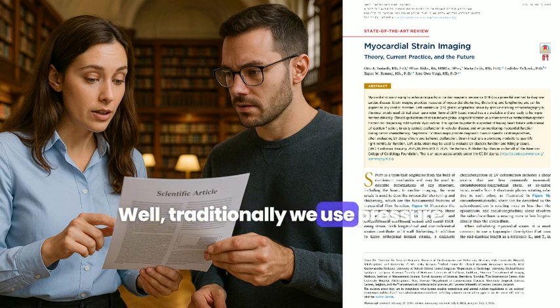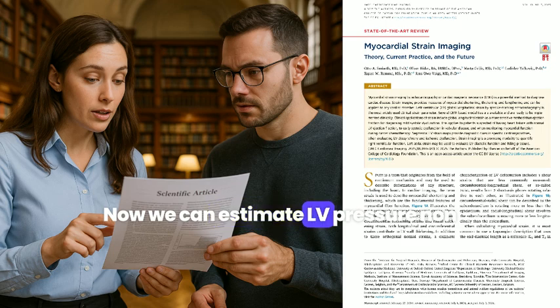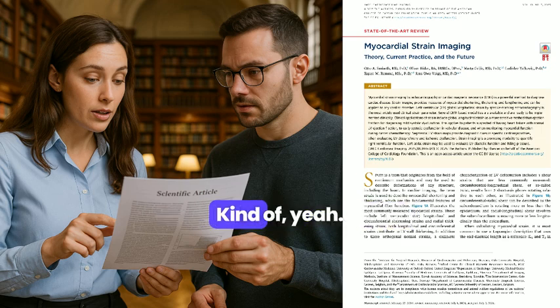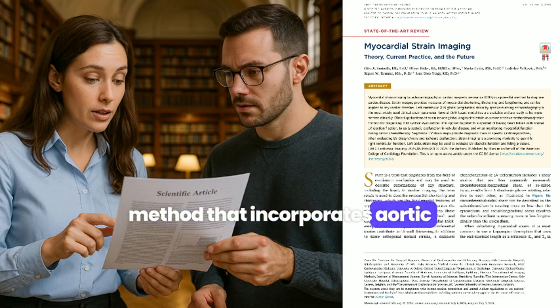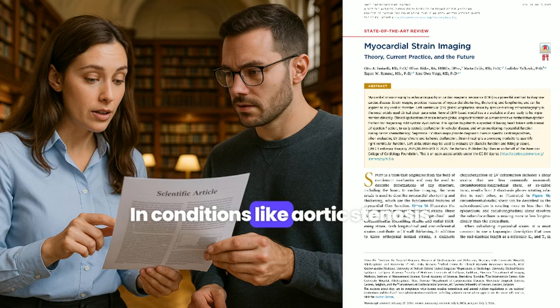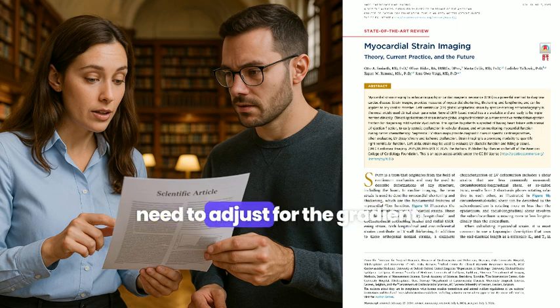Well, traditionally we use pressure-volume loops, but those are invasive. Now we can estimate LV pressure non-invasively using echo and cuff pressure and combine that with STE strain data to create pressure-strain loops. Like a virtual pressure loop. Kind of, yeah. There's also a more clinically used method that incorporates aortic diastolic pressure to calculate various myocardial work indices. Need to be careful in conditions like aortic stenosis or HOCM, where cuff pressure doesn't equal peak LV pressure. You need to adjust for the gradient.